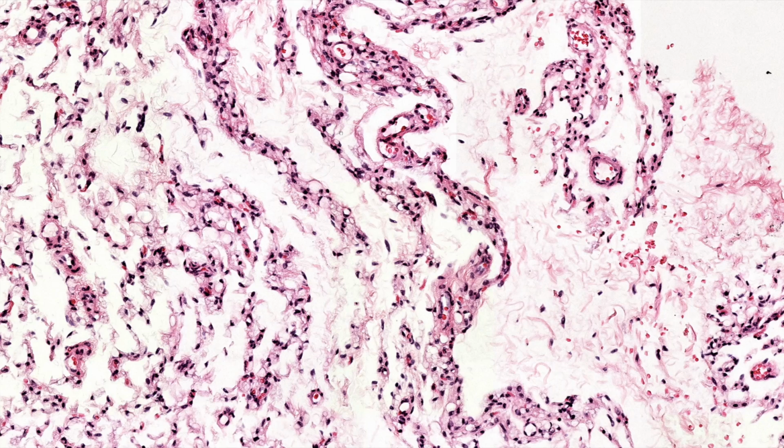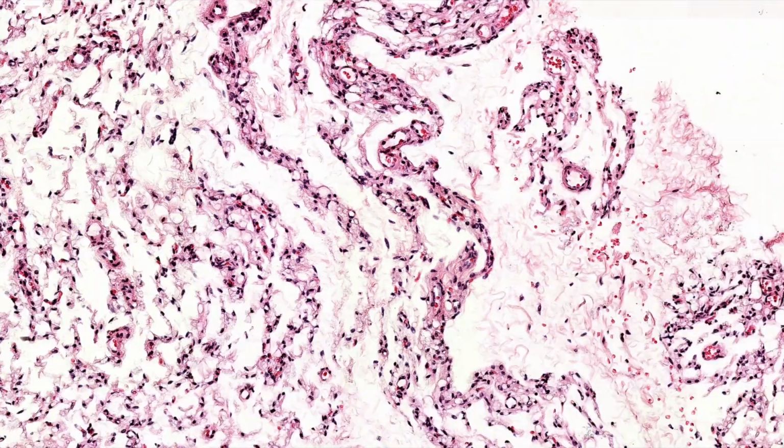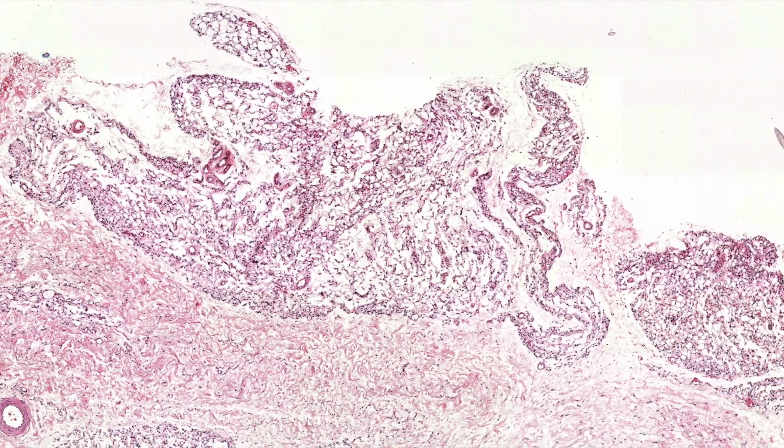you probably don't see very much in dermpath. I know I don't see it in dermpath, and it's probably not in a lot of study sets. But for pathologists, I think it's a really important pitfall to know about, that those cells are not carcinoma. Easy to sort this out. Just do a keratin. Keratin will be negative here, okay? But the other thing from lower power, Nick, like you said, the really helpful thing here is the fat.